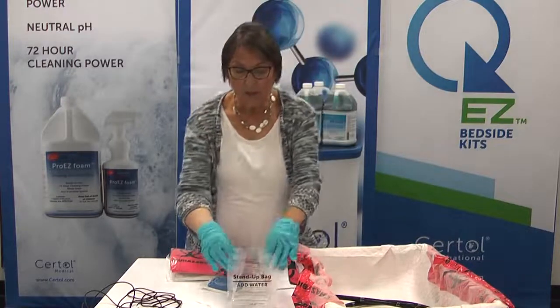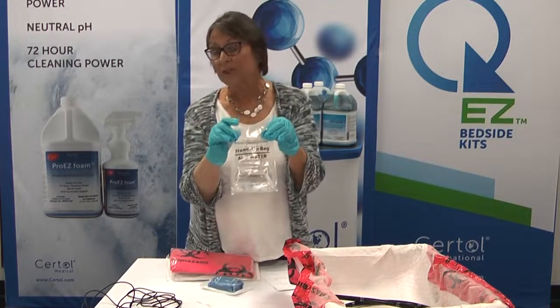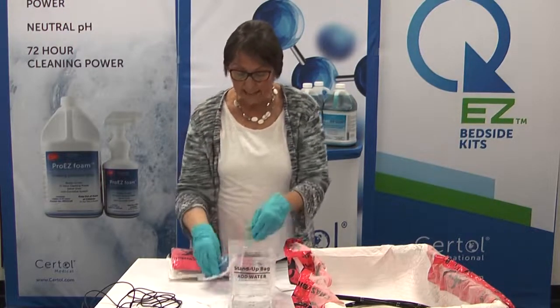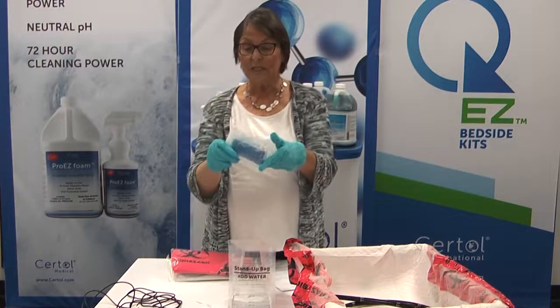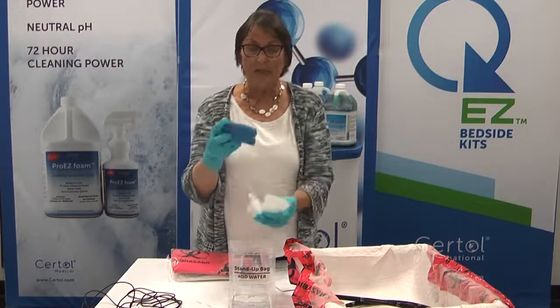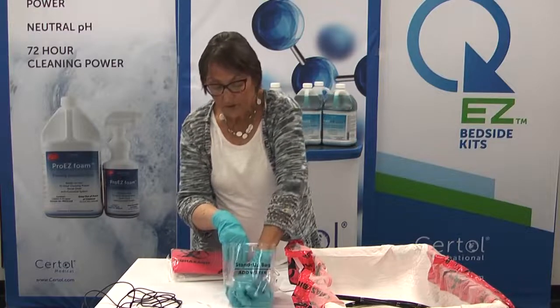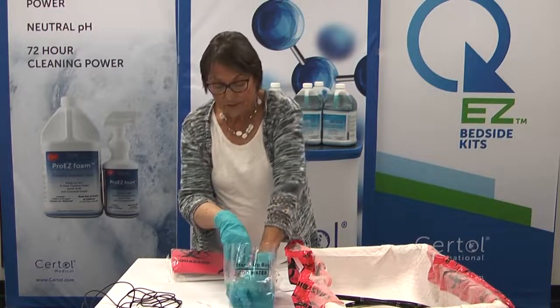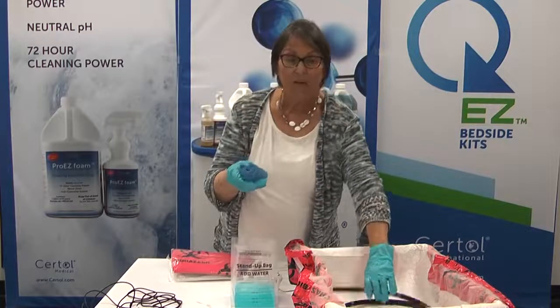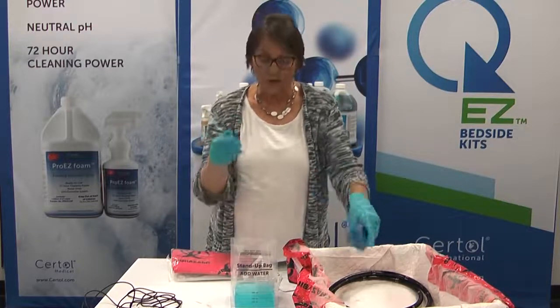Now we're going to show you — with our stand-up bag we have 500 milliliters of solution in there, and you can see the bag is marked with different levels to match the solution amount you need to suction through your particular scope. In this bag we are going to use our pre-saturated sponge, which is designed to be easy to use. It opens easily, the sponge is saturated with ProEasy AW Quad. We put it inside the bag, squeeze it three to four times, and now the solution is activated. We now have the sponge ready to use for cleaning the outside of the scope, and we also have the solution ready to suction through your scope.